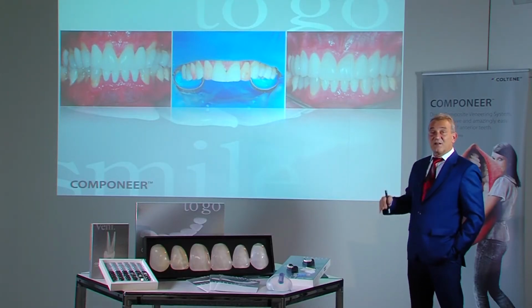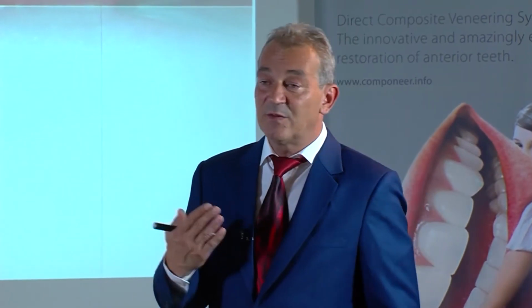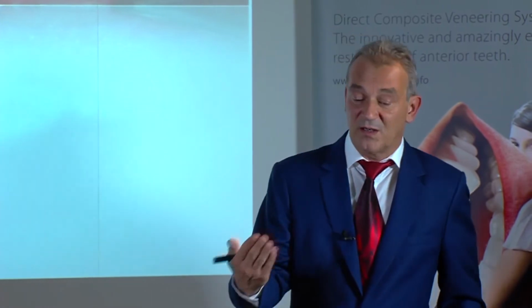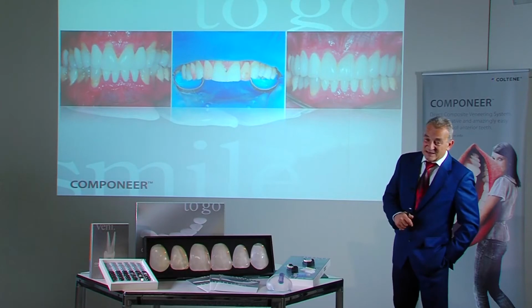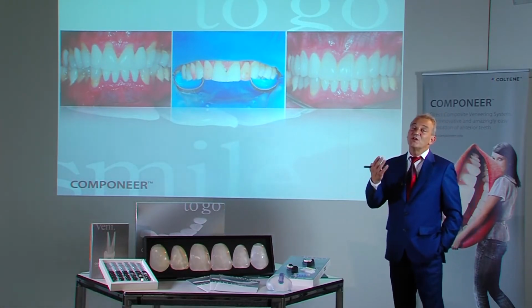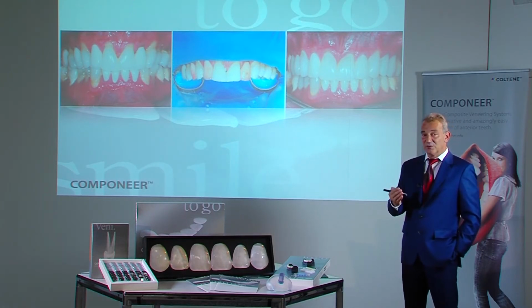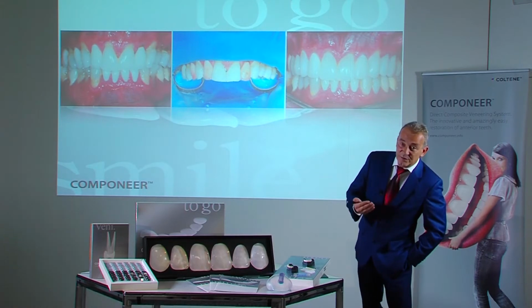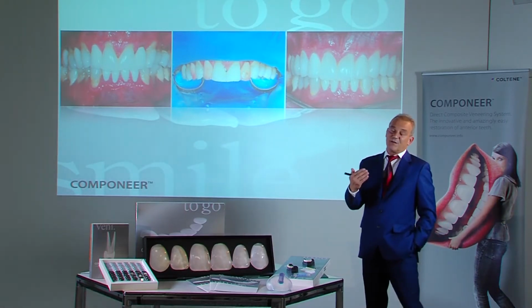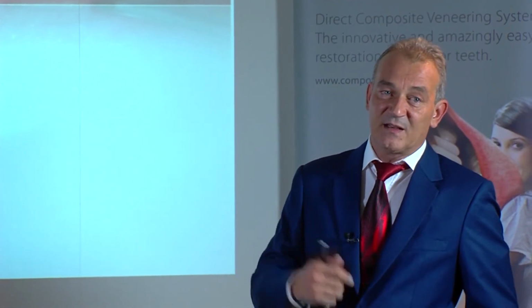The surfaces of the ceramic sections were prepared somewhat. This reduces the ceramics. It is especially important to remove the glazing of the ceramic to obtain an optimal as possible surface for adhesion after subsequent sandblasting or etching. In such instances, it is important to inform the patient that the bonding power to ceramic is roughly 30% less than to natural tooth substance.